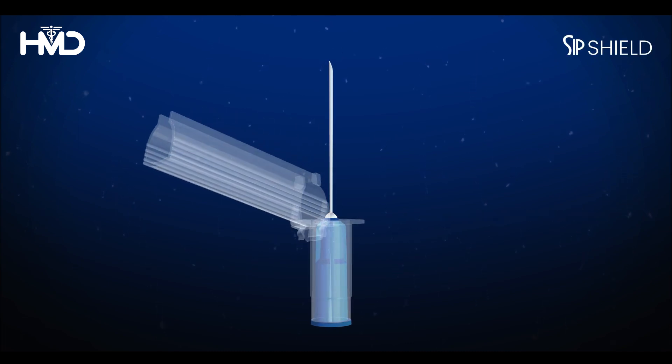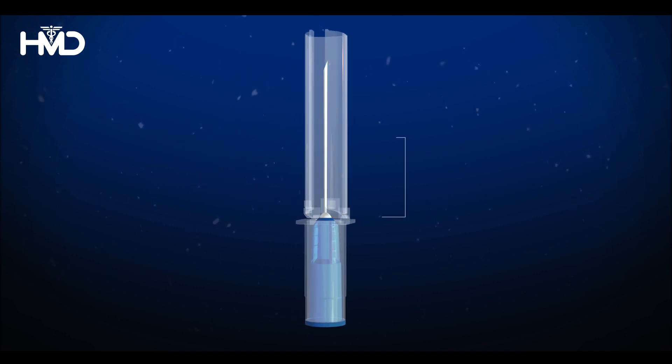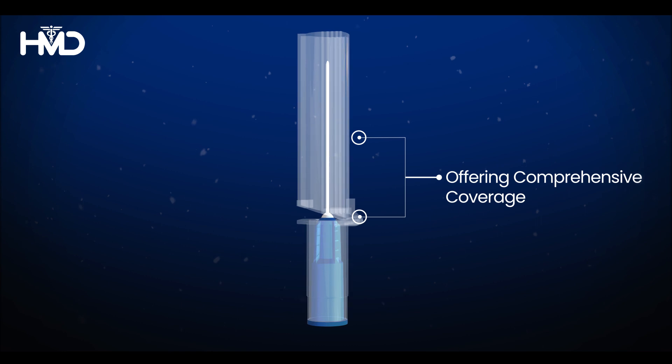The hub and cannula are gradually covered with a sharp injury prevention SIP shield. The safety cover fully encloses the needle, offering comprehensive coverage.